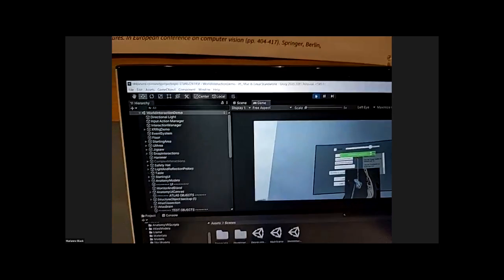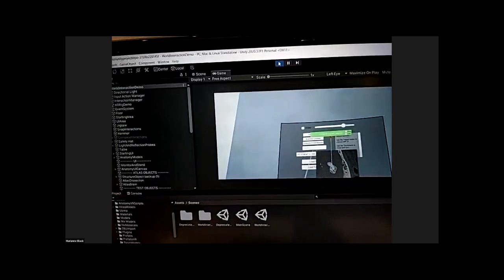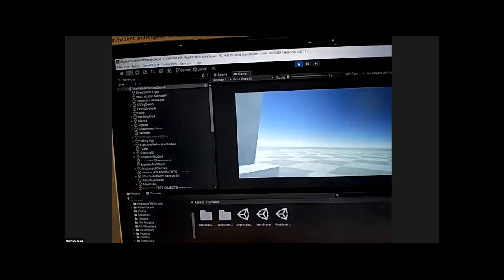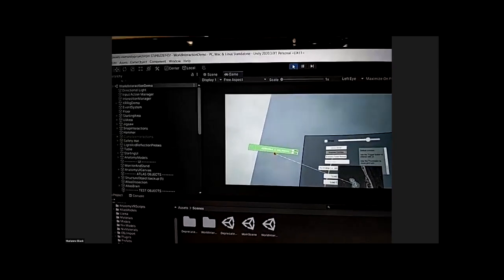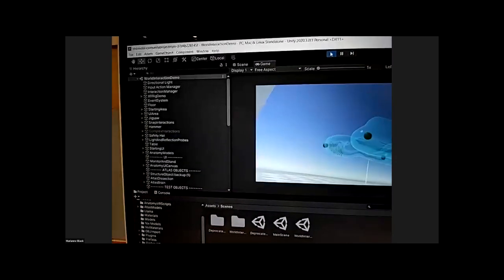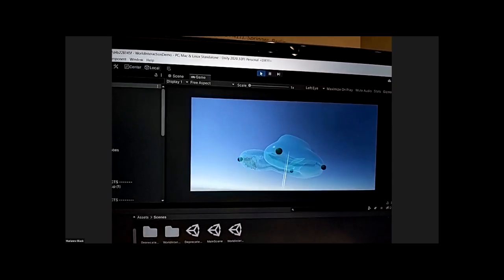Okay. So let's say now you want to analyze the cochlea and see some particular distances and dimensions of the cochlea. You just click here on evaluate cochlea. And then if you look back here, okay, I don't see it. Where is it? Let's see. Okay, can you see it? Oh, yeah, that's super cool. Yeah, you can see it over here. And you can see certain markers that indicate particular landmarks in the cochlea.